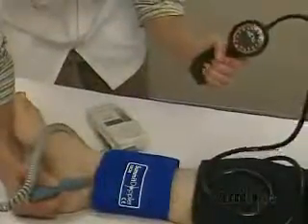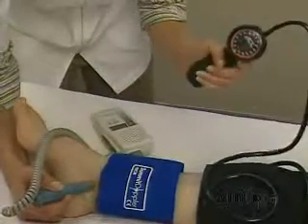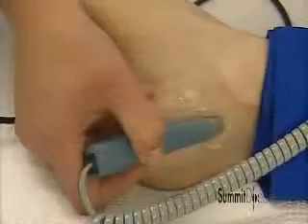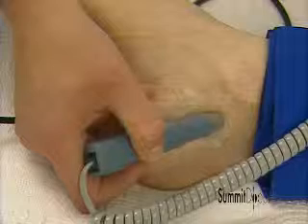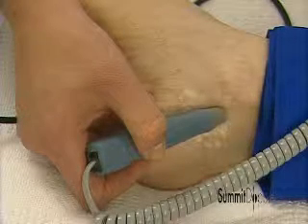The posterior tibial artery is located on the inside of the ankle. Maintain a 45-degree angle and move the probe slowly across the artery to obtain the loudest signal. Point the probe toward the incoming flow, in the general direction of the knee.